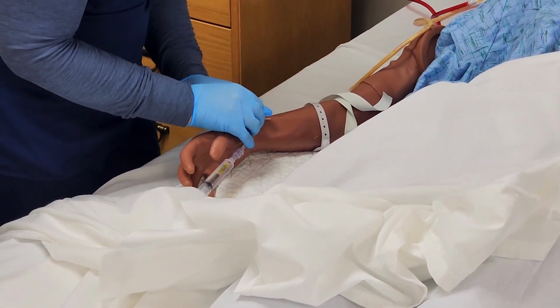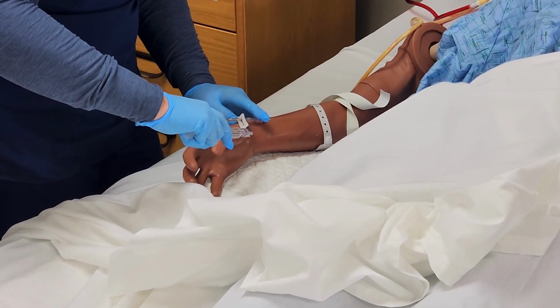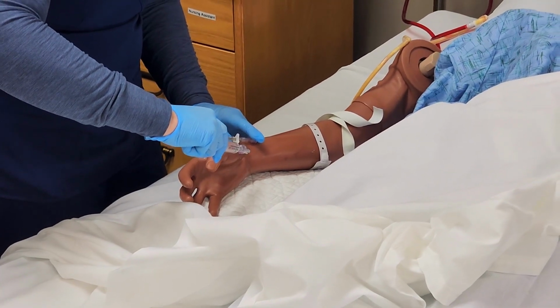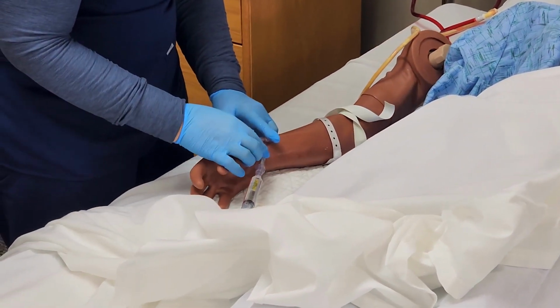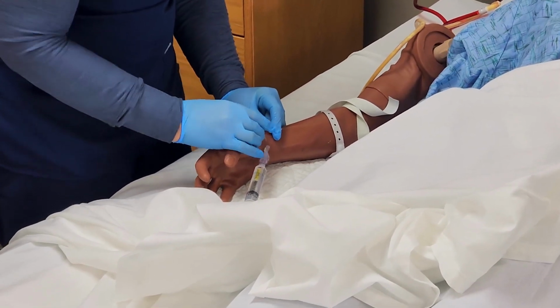Okay, securing your IV, and you're going to see blood return, and then you're going to flush with approximately 3 cc's of normal saline. Good. Once you have that flushed, you're going to clamp the IV.